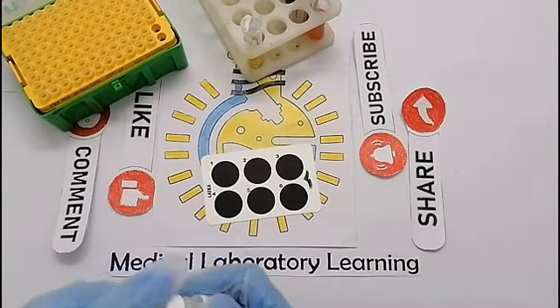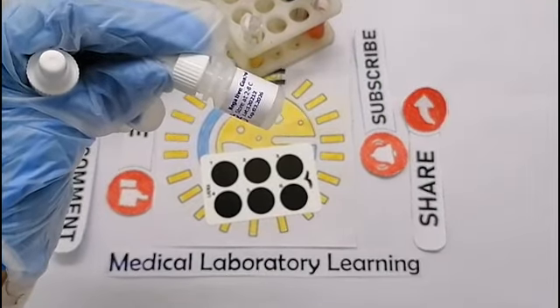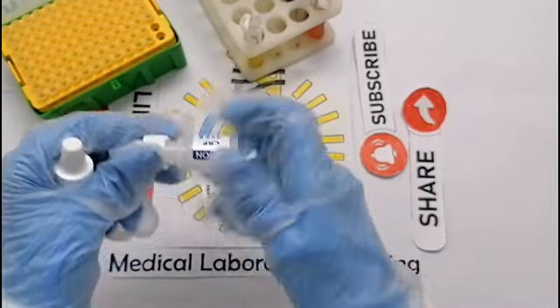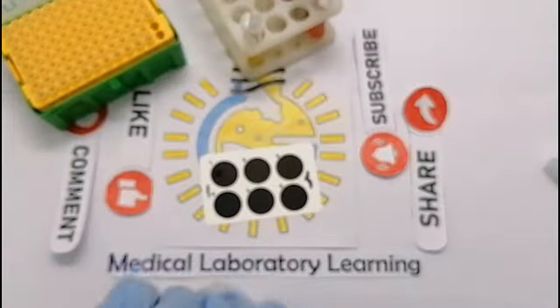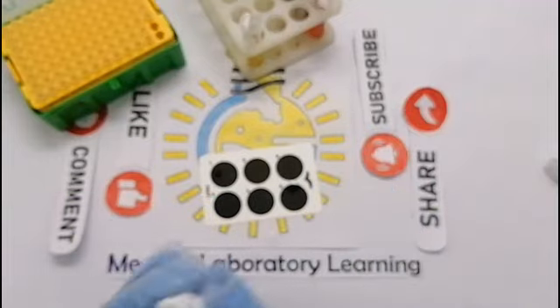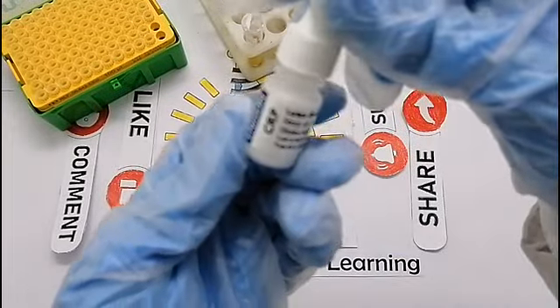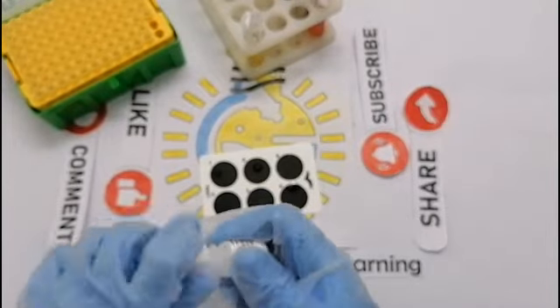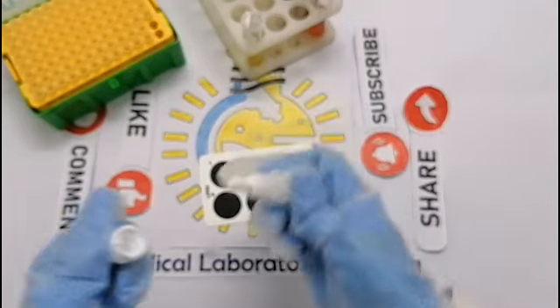First, I open the negative control solution and I place 1 drop of it in the first circle. Then I place 1 drop of positive control solution in the second circle. I add 1 drop of CRP test solution to both circles and mix them completely with an applicator so that the surface of each circle is completely covered.